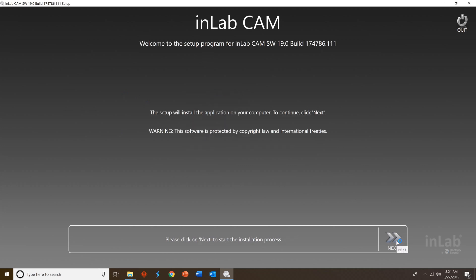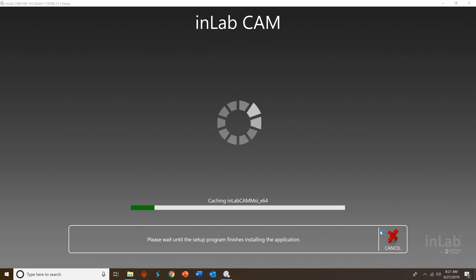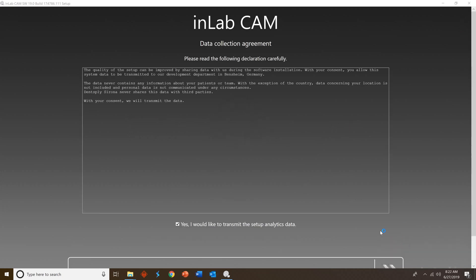Go ahead and press next one more time. Make sure you're comfortable with where the files will be installed on your computer, which we are, so press next and allow up to 10 minutes for the software to install.